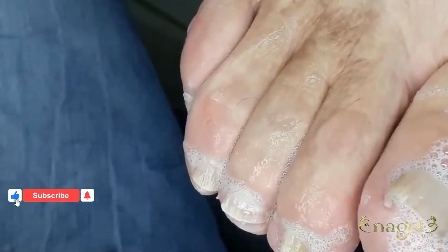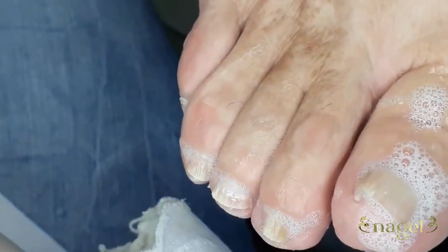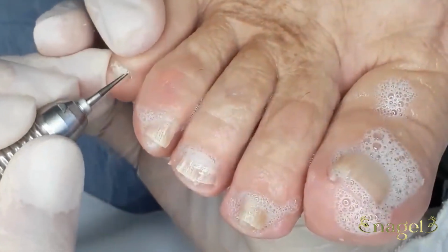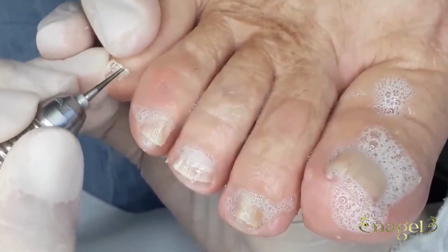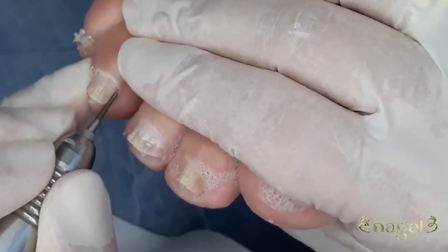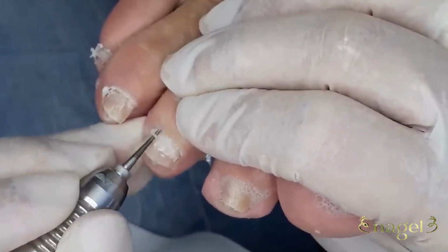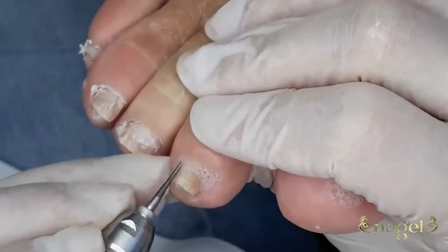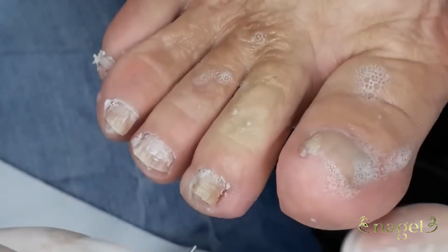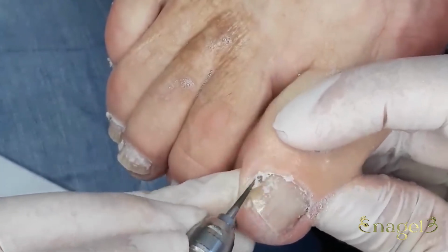Throughout the procedure, my focus is on my mom's well-being and that of all my patients. Ingrown toenails and fungal infections may seem like just a detail, but those who experience them know how bothersome they can be. My mom, for example, said she sometimes gets used to the pain, but that's not normal. My goal as a podiatrist is to restore comfort and quality of life. That's why I work calmly, sterilizing all instruments and ensuring every step is done safely. And of course, I always talk with her, checking if everything's okay, because care goes beyond technique. It's about listening and understanding the patient.